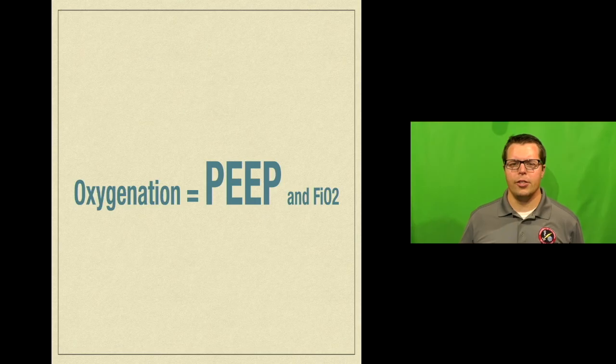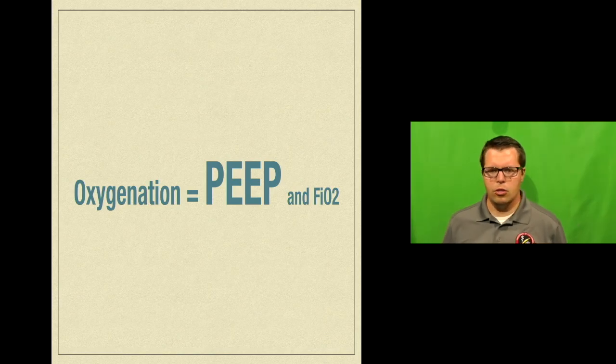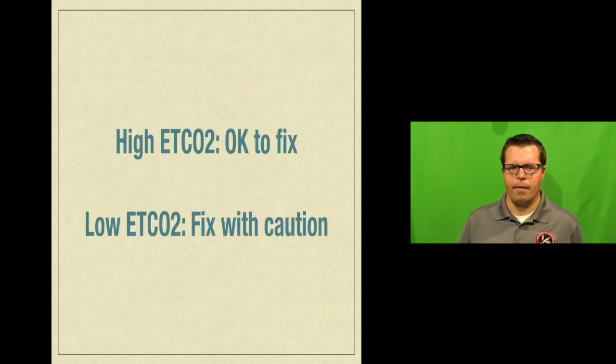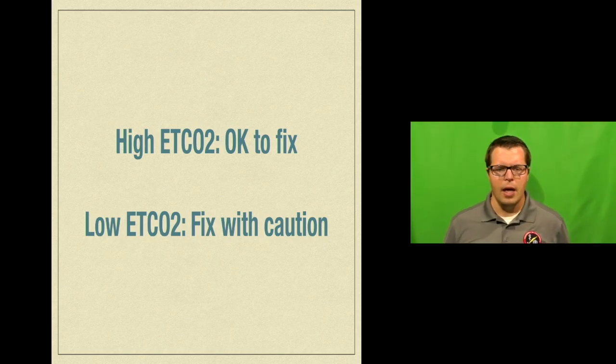Remember that oxygenation is primarily driven by PEEP and a little bit by FiO2. If you've got to pick one or the other, choose PEEP to change first. And then it is okay to fix a high end-tidal CO2, generally speaking, especially in folks that don't have obstructive lung disease. It's generally speaking safe to fix a relatively high end-tidal CO2.